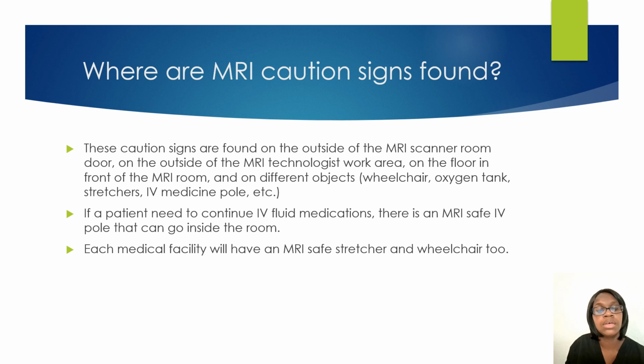So if a patient does need to continue IV fluid medication, especially if they are in the hospital or you work in a hospital as an MRI tech or student, there is an MRI safe IV pole that can go inside the MRI room. You want to make sure that you are following the proper precaution with disconnecting the battery if you have to remove the battery or the plug to the machine.